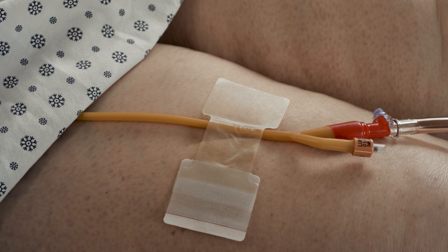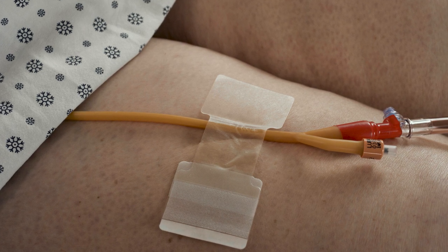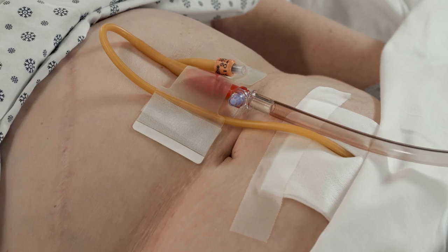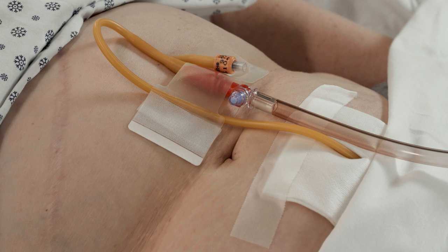Alternatively, the urinary catheter may be secured above the Y-port. The device can also be used to secure a suprapubic catheter and drainage tubing.